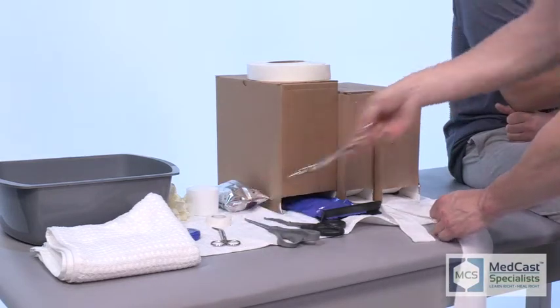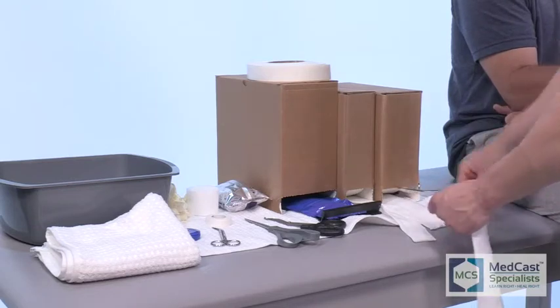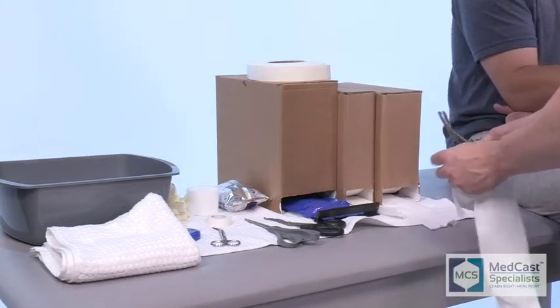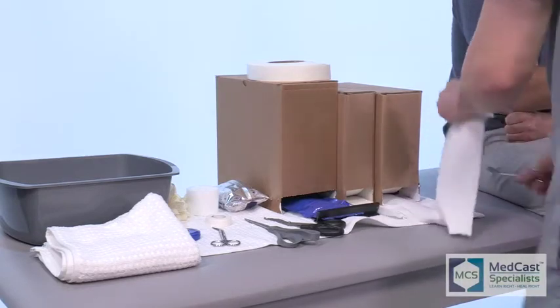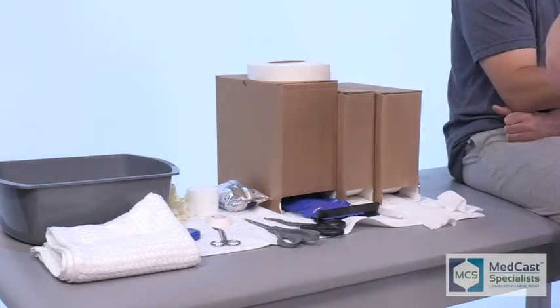I'd like to take things all the way back to the basics. So simple definition, radial gutter, ulnar gutter. If you're on the radial side, thumb side, it's a radial gutter cast. It's a gutter because it's incorporating some of the digits. Same thing on the ulnar gutter cast. It's going to be on the ulnar side, but the gutter part incorporates the digits.